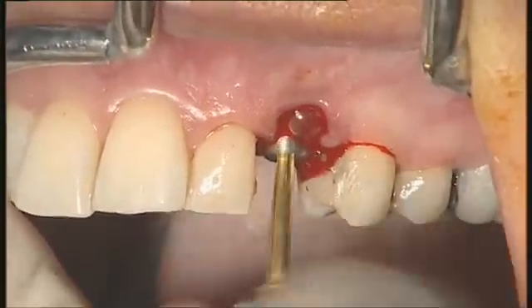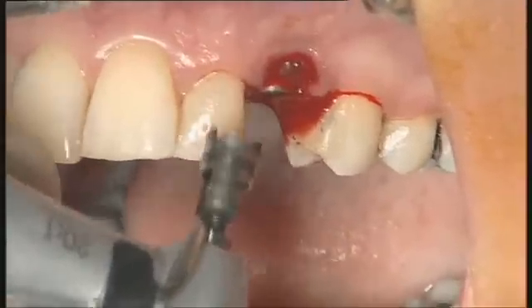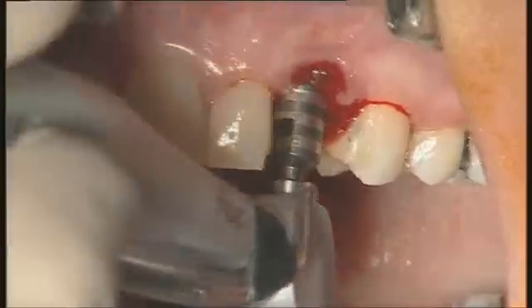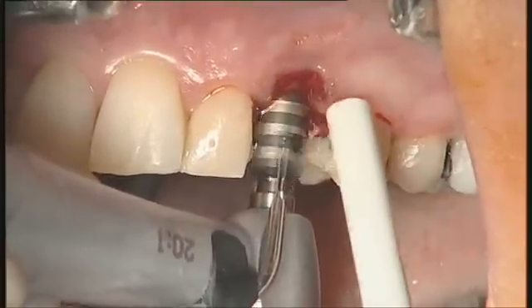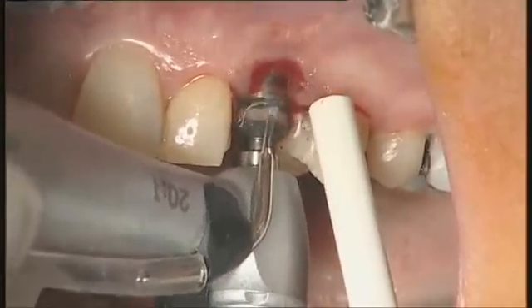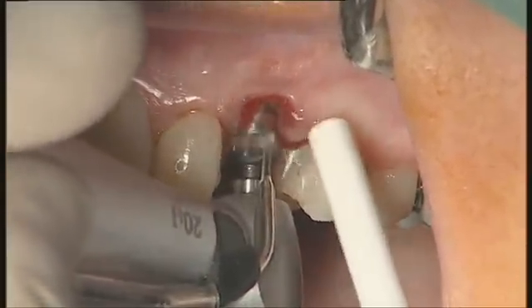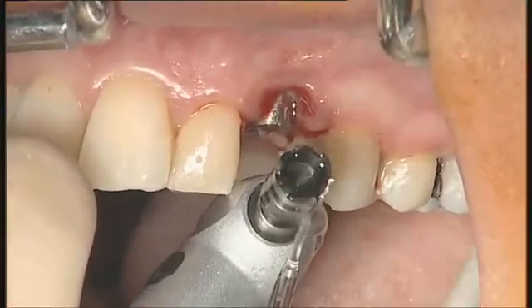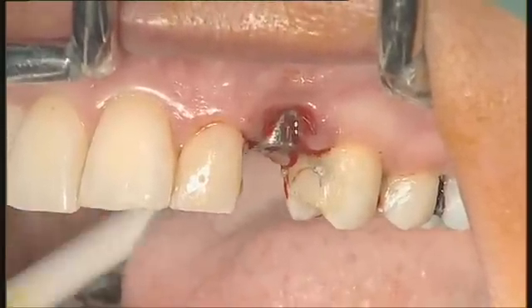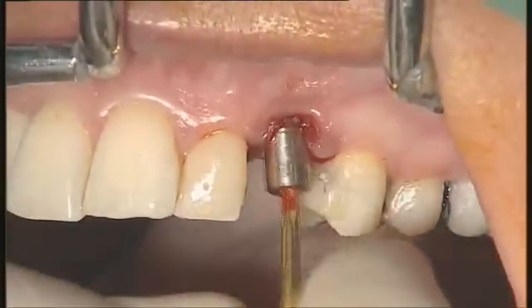Now I'm going to use what we call the bone mill. We are quite sure that we have some bone on the palatal that will impair the placement of our abutment — a static abutment. This instrument is very easy to use; it is guided by a healing abutment. You just insert this drill, and the excess bone has been removed.